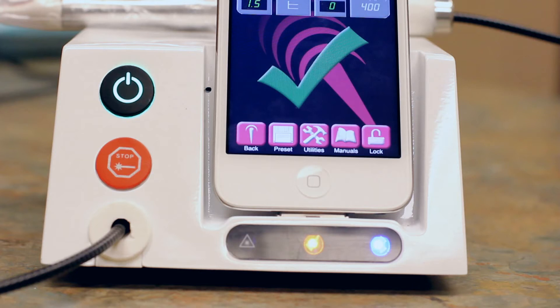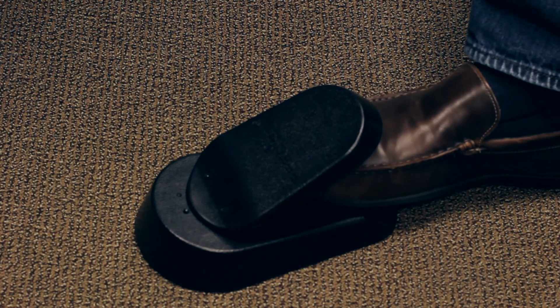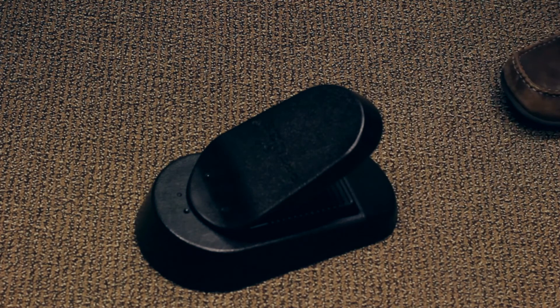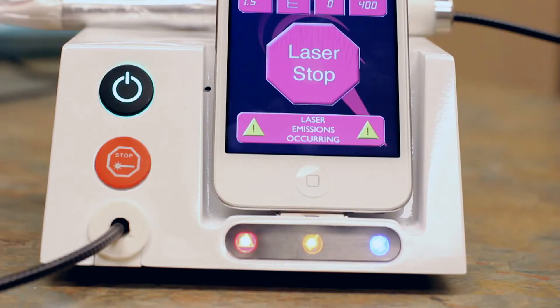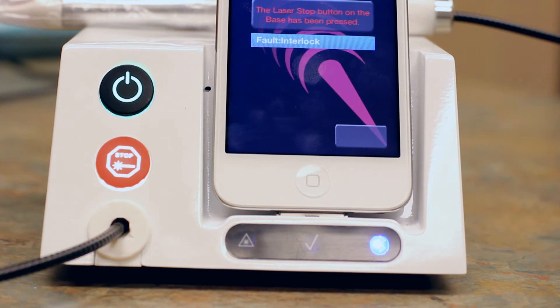Unless you turned it off, the aiming beam will now be visible. The main beam doesn't activate until you step on the foot switch. Position the tip over the treatment site, then step on the foot pedal to activate the main beam. You will notice a large red button will appear on the display — this is the laser stop button, redundant to the button on the base module. Pressing it will turn off the laser beam and show a laser stop warning screen.